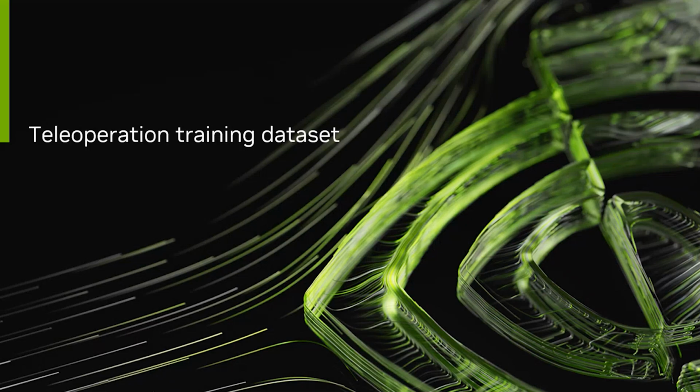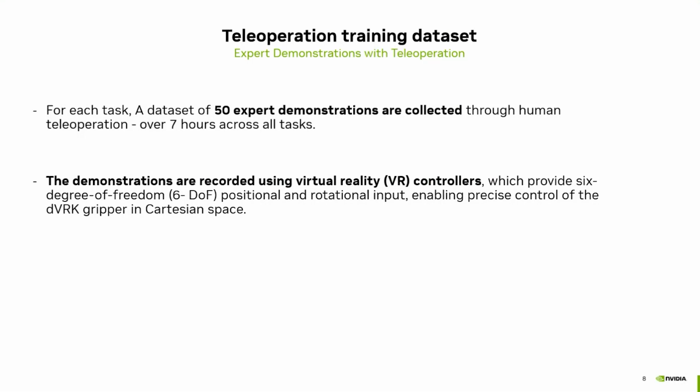Let's now discuss a bit of how we collect the teleoperation dataset. For each of the tasks that I'm going to mention in the next slide, we collected 50 expert demonstrations through human teleoperation, which is in total around 7 hours of demonstrations. We recorded these demonstrations using VR controllers, which provide us 6 degrees of freedom, and basically mimic the controls of the dVRK gripper in 3D space. I want to highlight the importance of using VR technology here, which helps us capture all the nuanced actions of the expert surgeons.